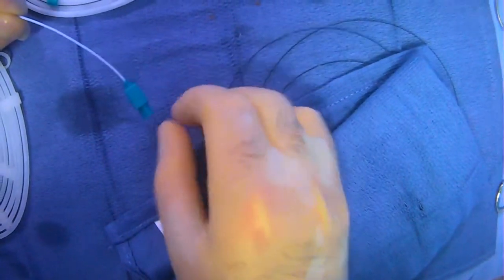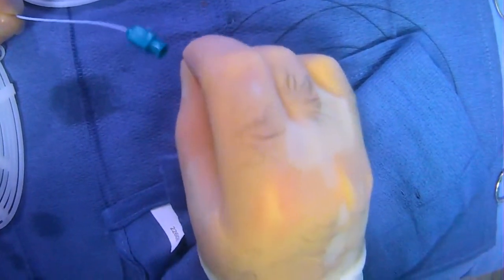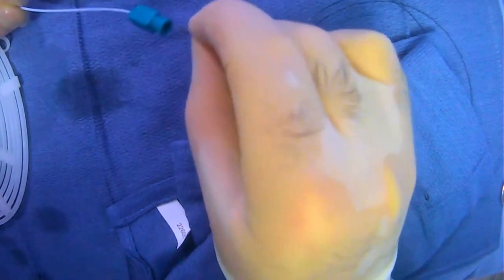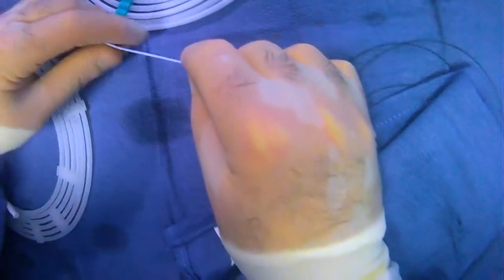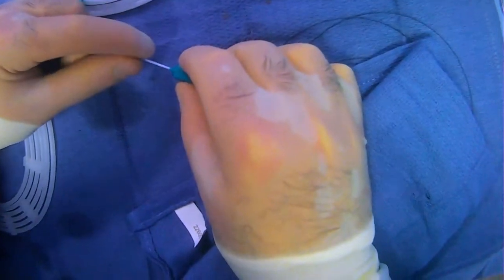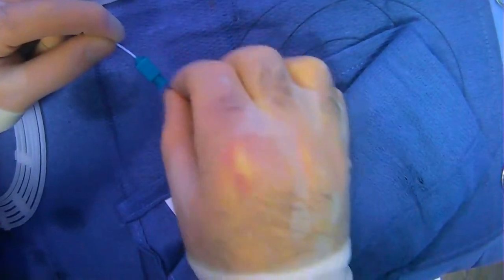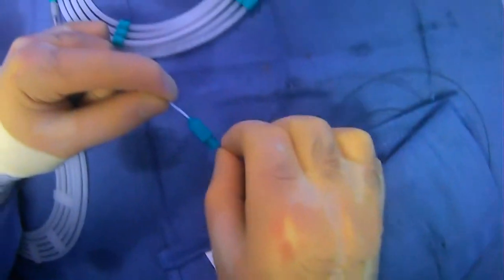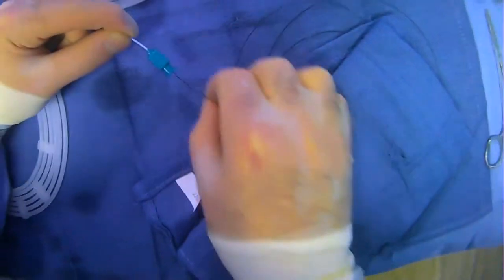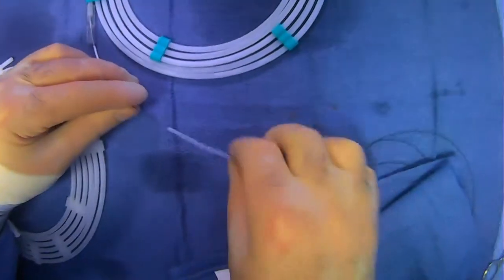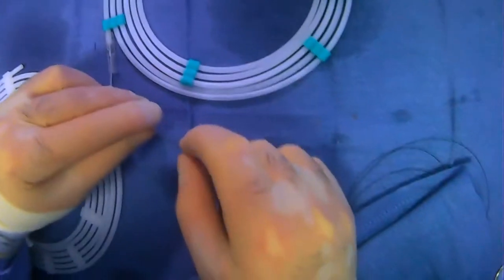And now we'll try to do our best to push our wire into the microcatheter. And you can be strategic here and hold like this. And this sounds and seems promising. I think we're getting the wire in where we want it to go. And you can see it's in the microcatheter.